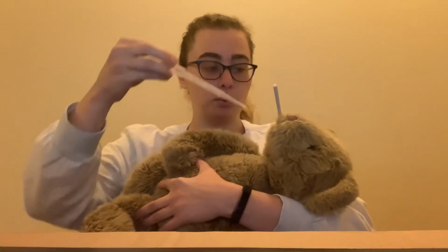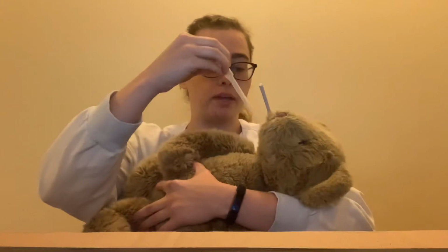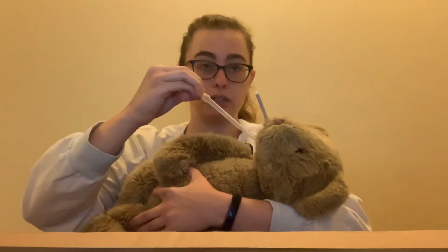After you place them on their side and insert the OG tube and ensure placement, here's my large syringe. We are going to insert 200 to 300 mLs of normal saline. You are then going to aspirate that and get rid of it. You are then going to do this multiple times, putting in the 200 to 300 mL and aspirating until the fluid that you aspirate is clear.